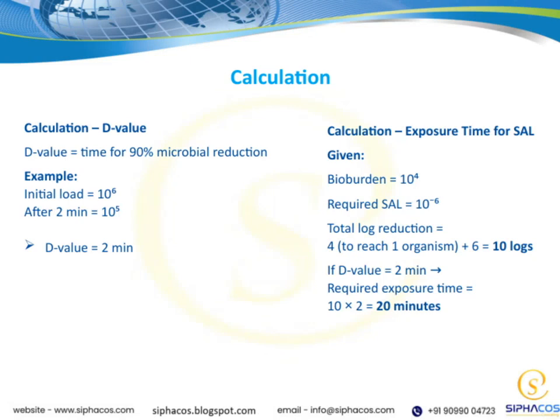Let's walk through the calculation of exposure time for SAL. First, we start with our bioburden, which is 10 to the power of 4, or 10,000 organisms.